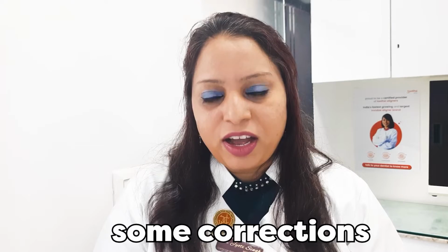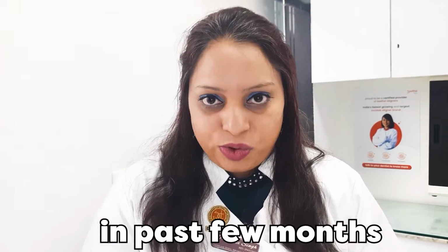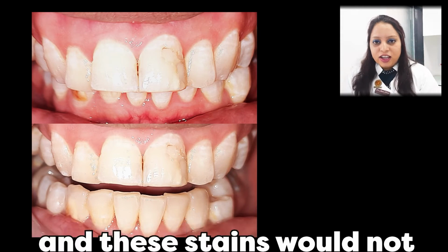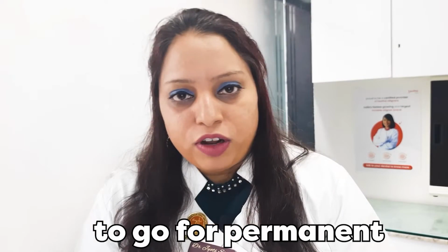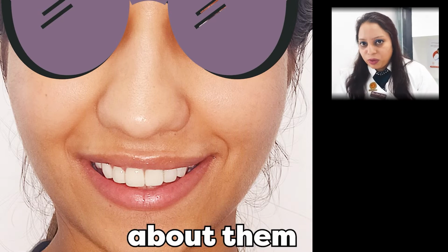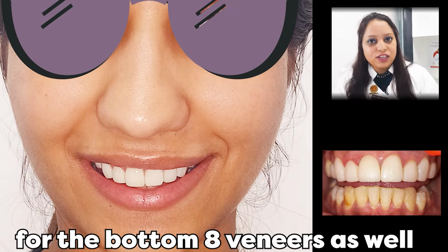Today, let's see some corrections that were done using veneers at our clinic in the past few months. The patient reported to us with white stains in her teeth with some non-alignment as well, and these stains would not go away even with whitening, and she wanted to go for a permanent long-lasting smile. Upper 8 veneers were done for her and she was so happy about them that she insisted on going for the bottom 8 veneers as well.